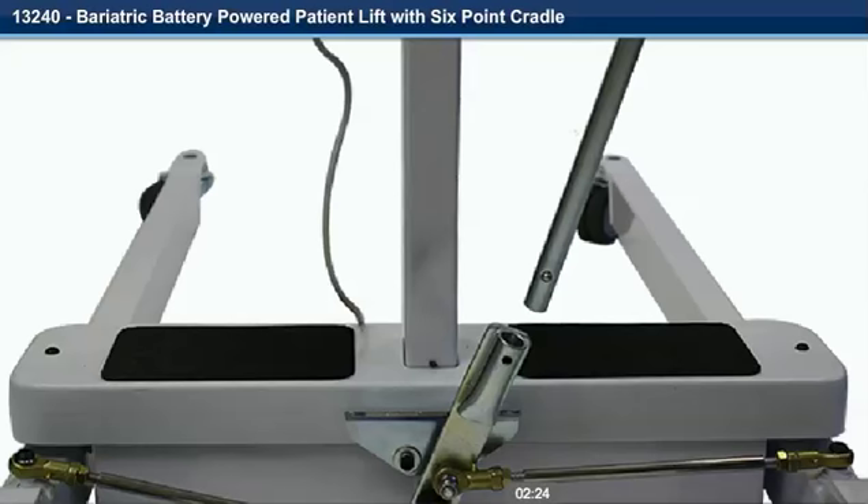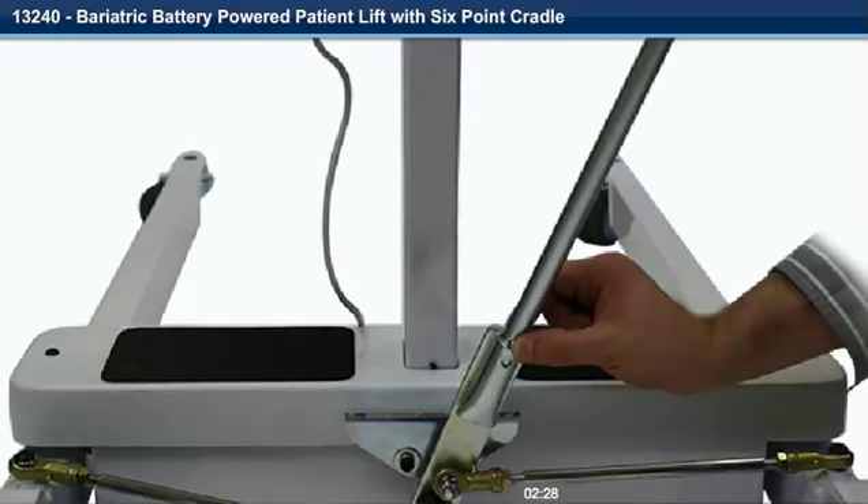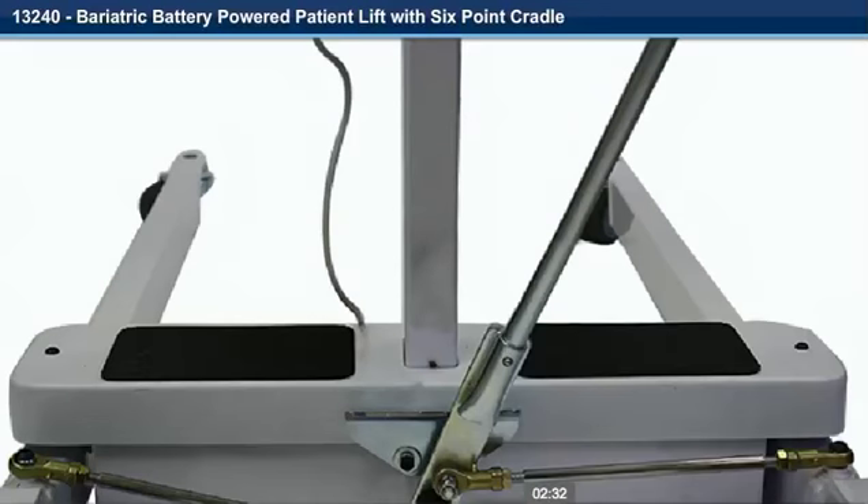Step 15. Insert the spreader bar into the receiver plate and depress the locking button. Continue to insert the spreader bar into the receiver plate until it locks into place.